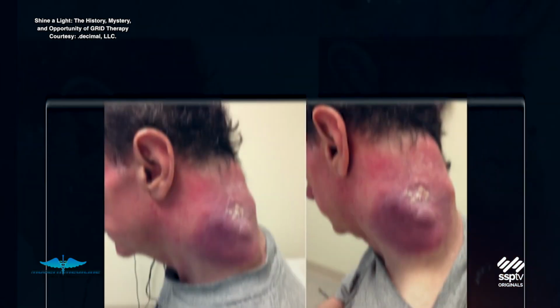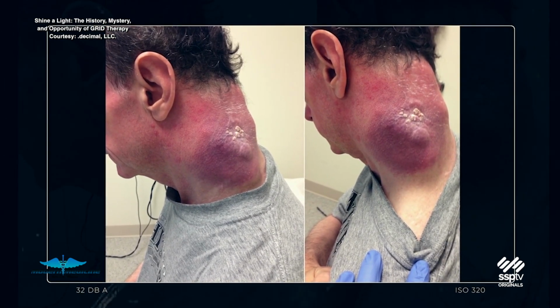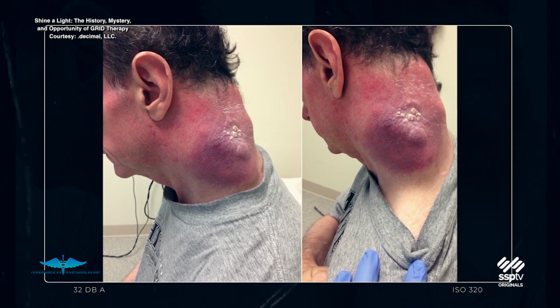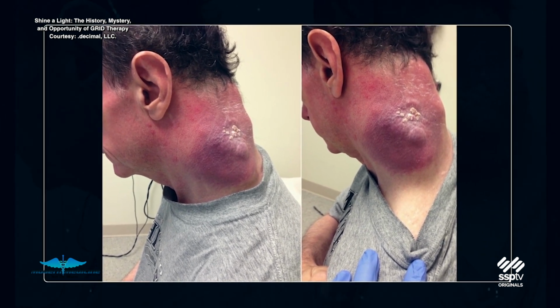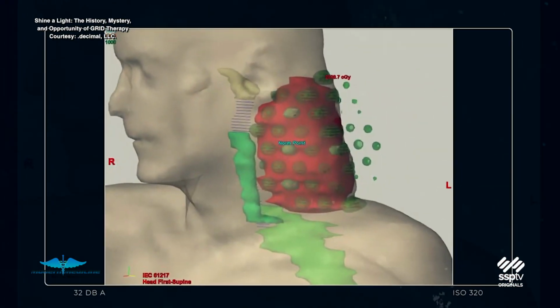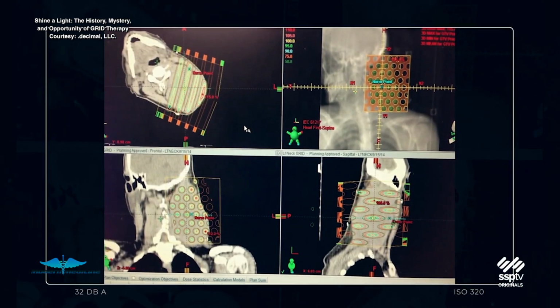And we treated, and this was a patient with melanoma, which is considered a radiation-resistant sort of tumor, a very difficult type of tumor. And this is a patient who had been through all the Yervoy, Opdivo, immunotherapy options that is usually given for melanoma. And this had progressed through all of those. So as a last-ditch effort, I gave this grid treatment.